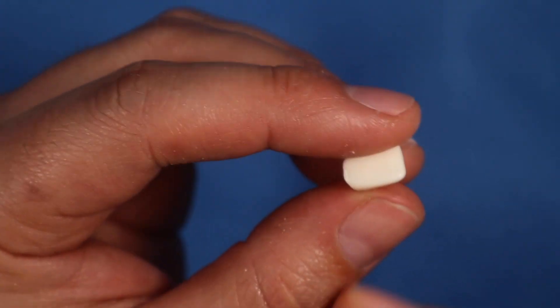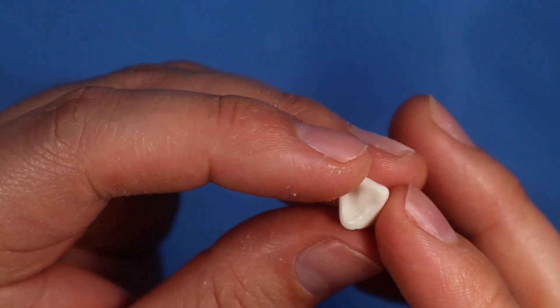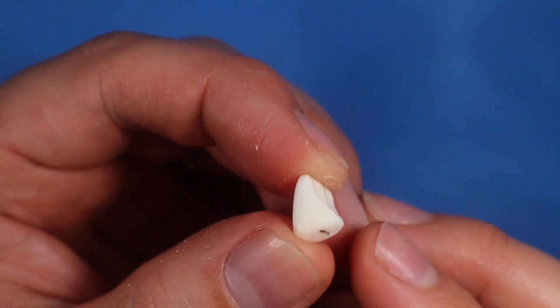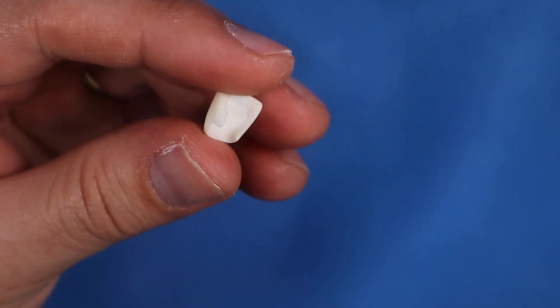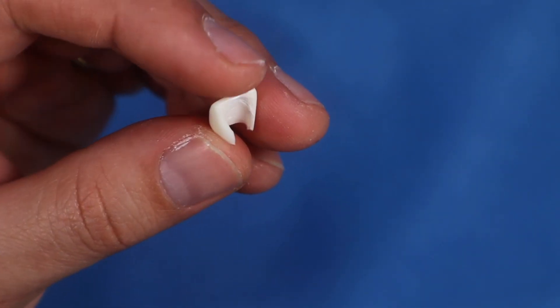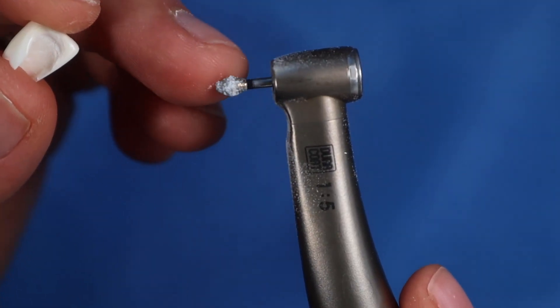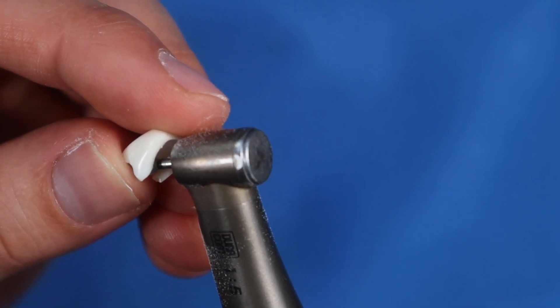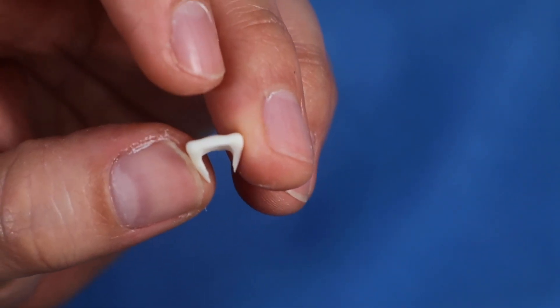Once you cut the crown off the root, you still can't use it yet because it has material that's going to block your cylinder — so go ahead and hollow it out. Now I've hollowed out the tooth quite a bit. You want to make sure there's no tooth material that's going to bind against that temporary cylinder. I just took my high speed with a football bur, stuck it in the middle, went up and down and side to side, swirling it to make sure it's hollow enough.